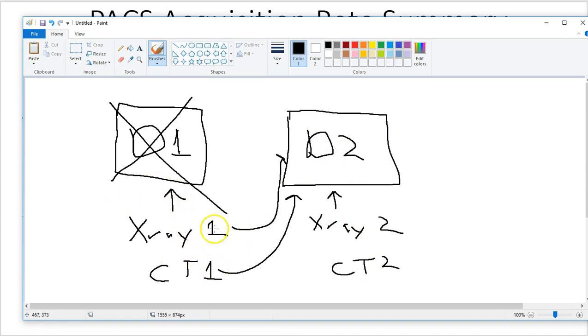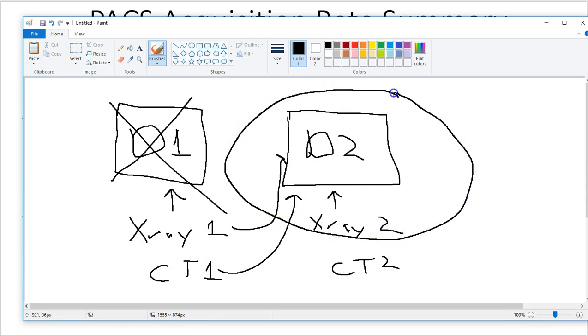So I can immediately have these two modalities fail over to send to the backup. Now, this server is going to have to do all the work. Instead of where it normally has 2 modalities sending through, it now has 4 modalities sending through, but at least I didn't lose anything other than this DICOM server.